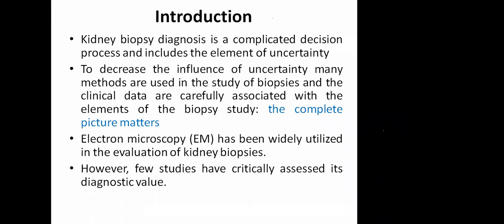such significant thickening. Then you, as a pathologist, will always discuss with the concerned nephrologist that we are seeing thickening of the membrane, which is commonly seen in diabetes, which can be seen in hypertension, or in something like light chain deposition disease. So we'll discuss whether this patient is diabetic, if there is a history of diabetes, and on EM also, we find diffuse homogeneous thickening of the glomerular basement membrane. So everything fits with that diagnosis.